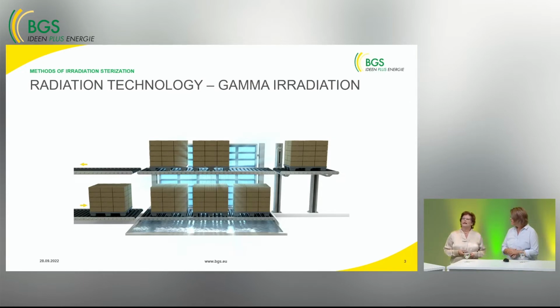First of all, let's consider gamma irradiation. Historically, gamma irradiation has been the most established process in the market. Due to this long application, the experience with regard to the effects of irradiation on materials and product properties is very, very comprehensive.